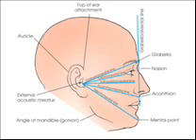Remove all metal and plastic from the patient's head, including removable teeth. Place the patient in a seated or standing position. Place a lead shield on the patient's lap.